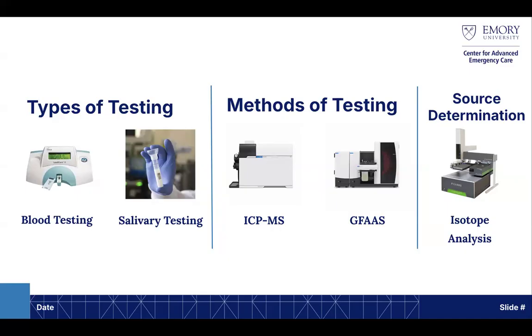However, as you said, this technology is potentially vulnerable to contamination of the skin and contamination of the environment. It does require some training of the staff that will perform these tests, and it requires calibration. As a matter of fact, my first study in Tbilisi was limited by a recall that happened in the US when the LeadCare analyzer was reporting inaccurate results. So I had to repeat the study using the LeadCare analyzer after the recall was over, as well as confirming it with the ICP-MS. So again, sometimes you have some issues running these tests through point-of-care testing.